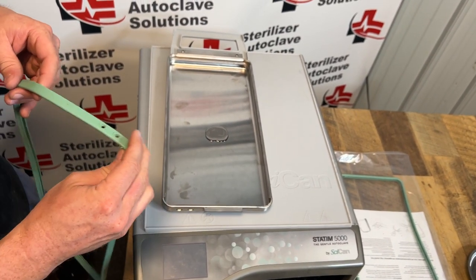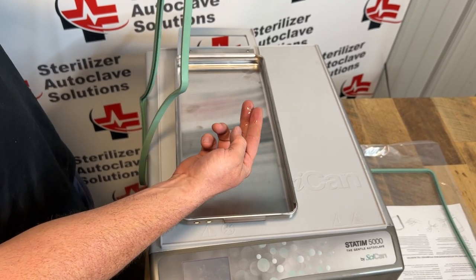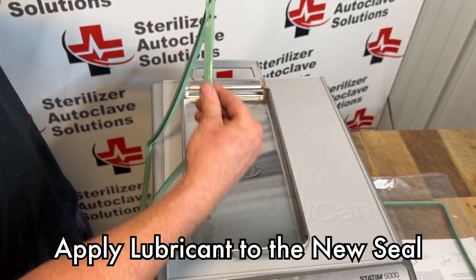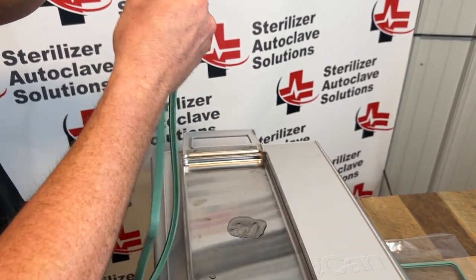Next I'm going to take my cassette seal — the reason I'm reinstalling this one is this is a brand new seal — and take two fingers, dip them in the lubricant, and just go all the way around this seal.